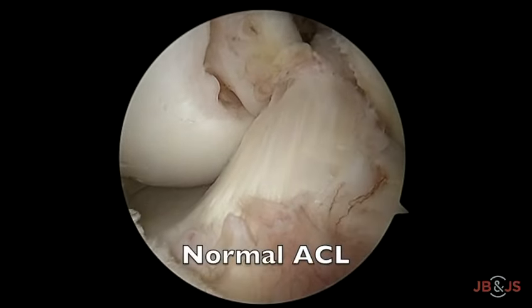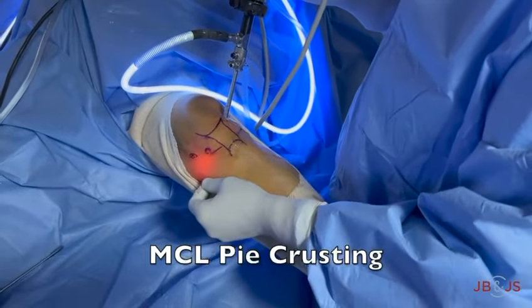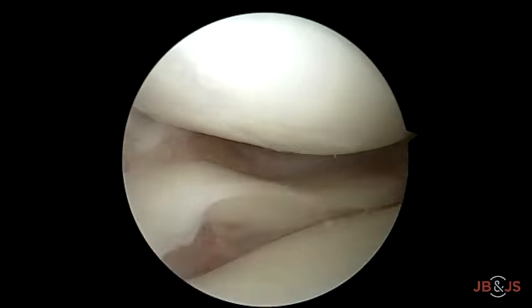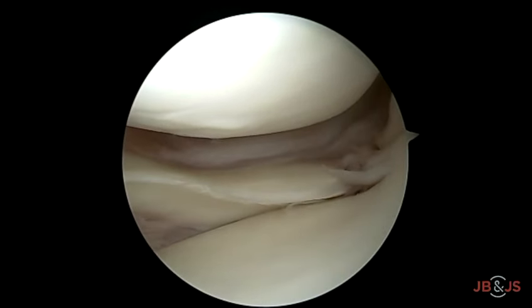Preceding with arthroscopy, the ACL was normal in our case. A 16-gauge needle is used to perform MCL pie-crusting at its tibial attachment. This opens up the medial compartment and aids in repairing the root as well as extrusion correction, and also prevents iatrogenic cartilage damage.